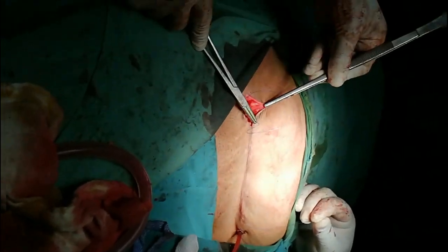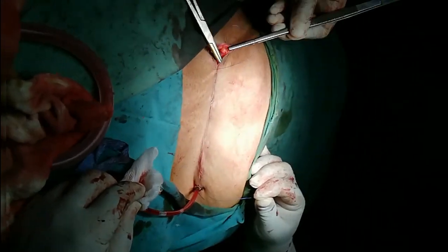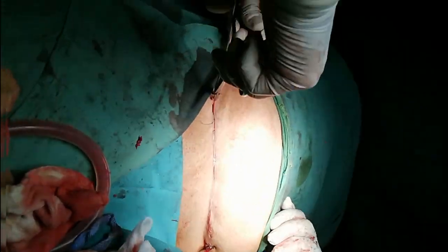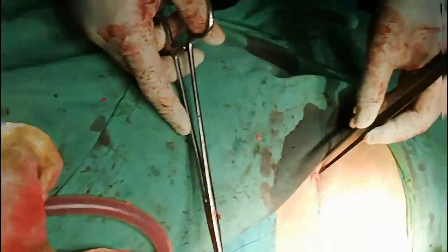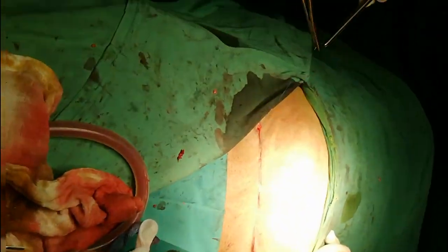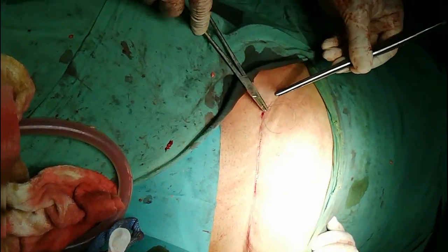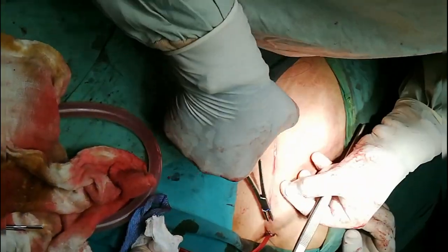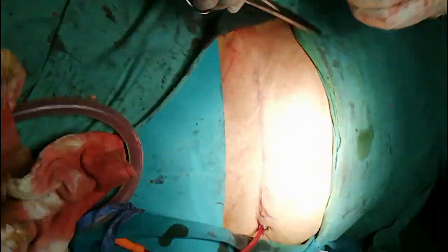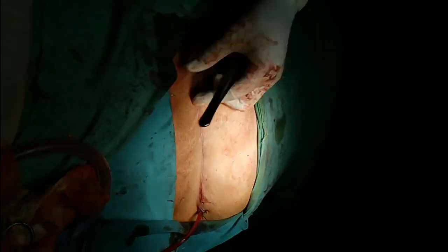In this case, the subcuticular stitches will be removed after 10 to 12 days. If the mesh repair is done correctly, the recurrence chances are very low for incisional hernia. Because this patient has completed her family, we placed the mesh. If the family had not been completed, we would have given a chance for the next conception first, and placed mesh only after family completion.